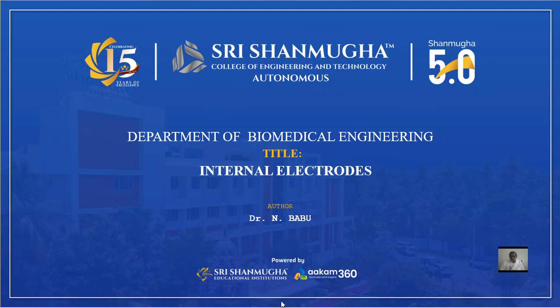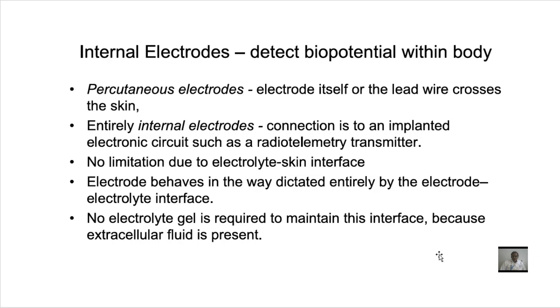Now I am going to explain about the internal electrodes. In previous slides, I explained about the different types of electrodes. Surface electrode we have seen. Now in this slide, we are going to study about the internal electrode for measurement of biopotentials. Internal electrodes are used to detect the biopotential within our body.